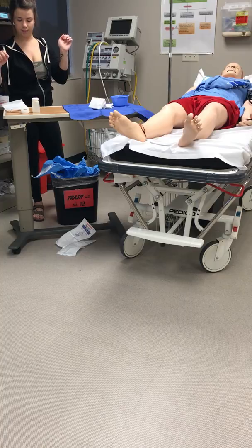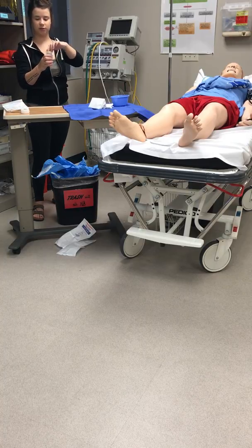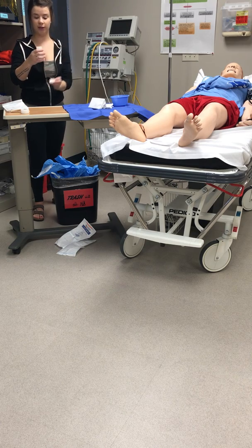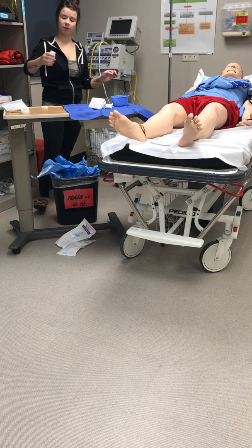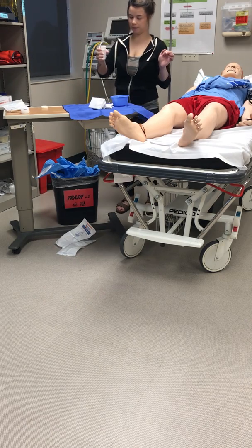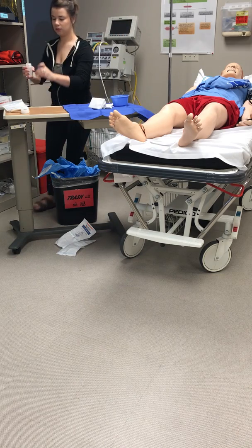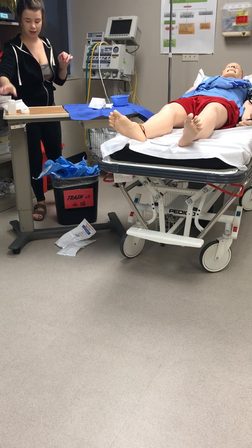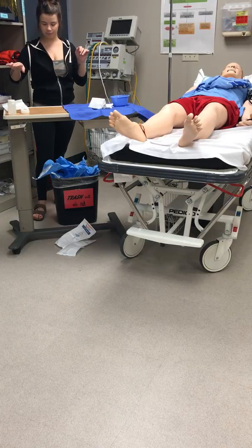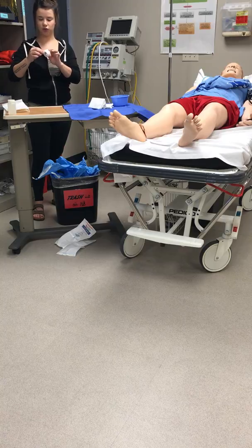To go ahead and lip my saline since it's already opened. And I'm going to have my hand over the label so that it prevents any ink from dripping in there. Alright. And then I sanitized the bedside table beforehand, and then I'm going to go ahead and just put some tape onto the side of the table.